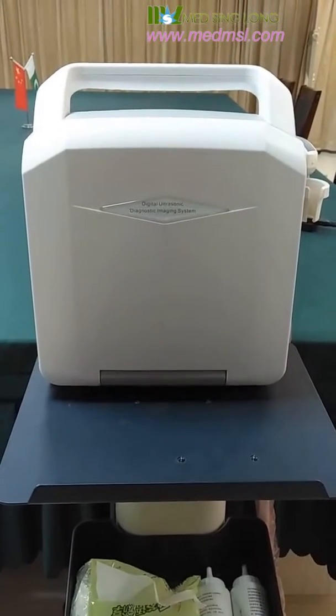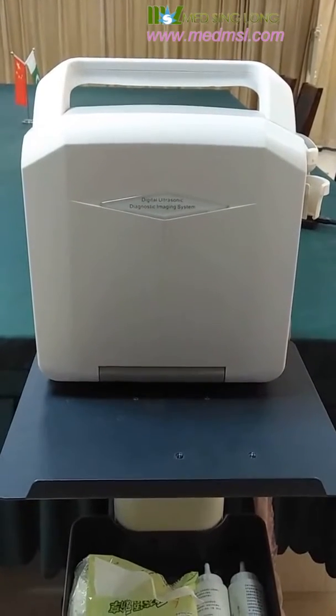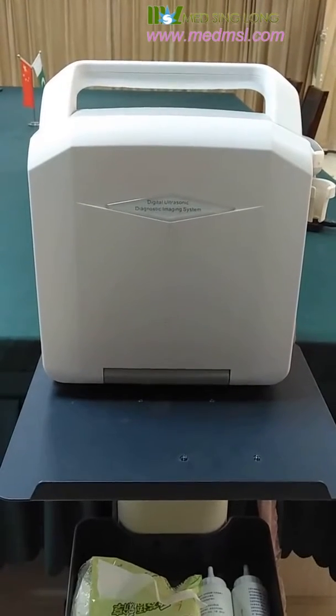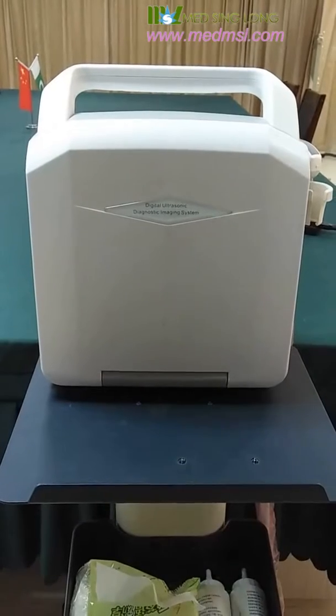Hello everyone, here comes the most popular black-white ultrasound machine — the Digital Ultrasonic Diagnostic Imaging System.